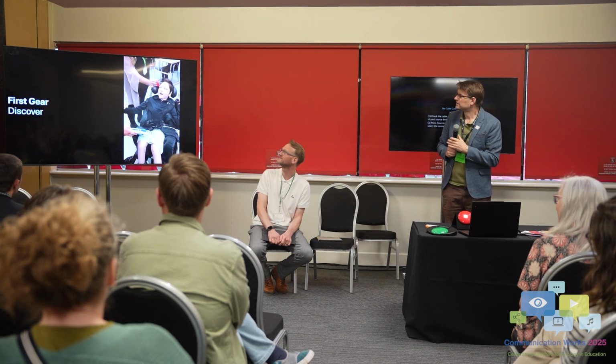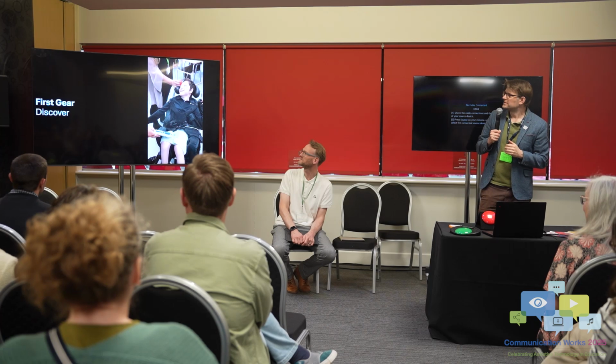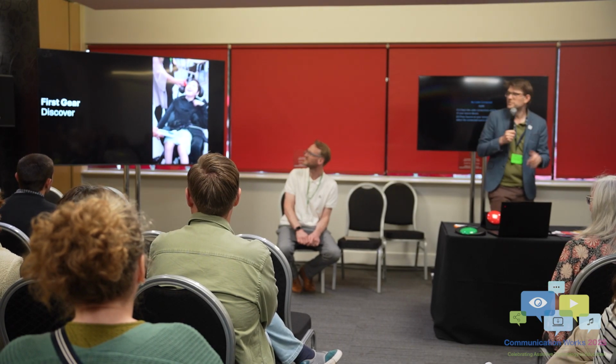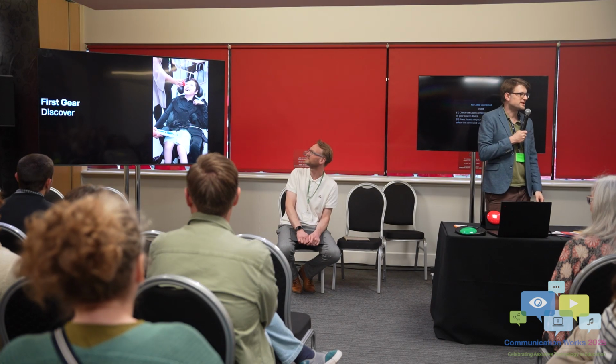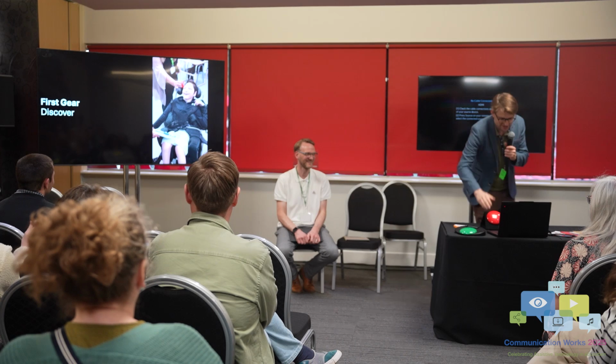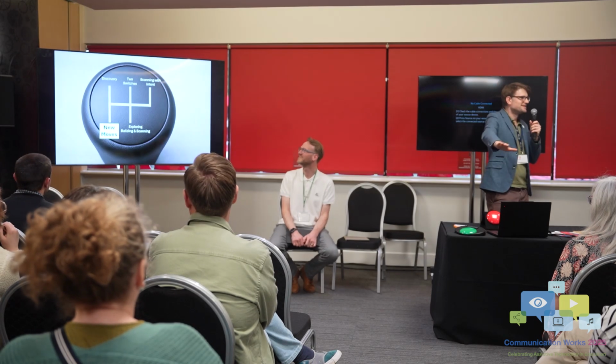So he's pressing the switch, in an accidental existing movement, not a new movement, and it's playing All the Single Ladies, which is a popular song by Beyonce. Yeah, so there we go, he's enjoying that. That's first gear.